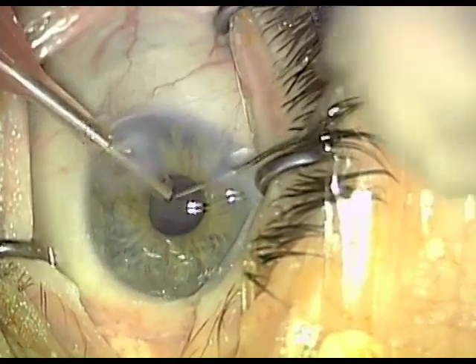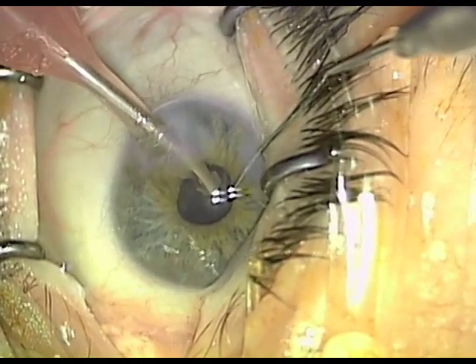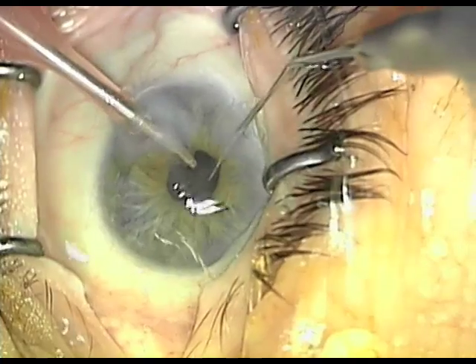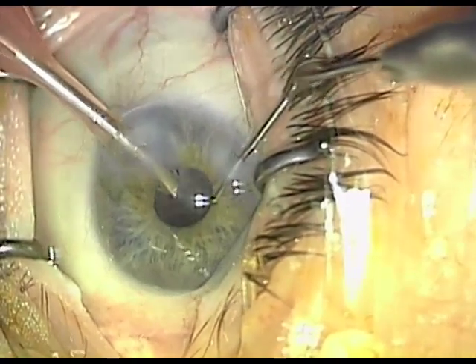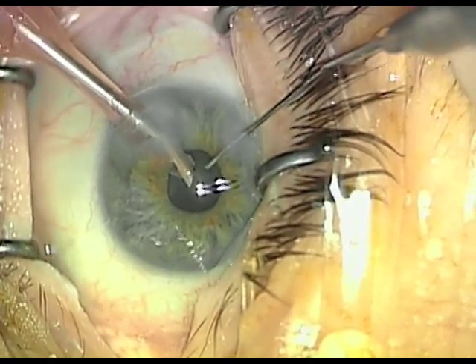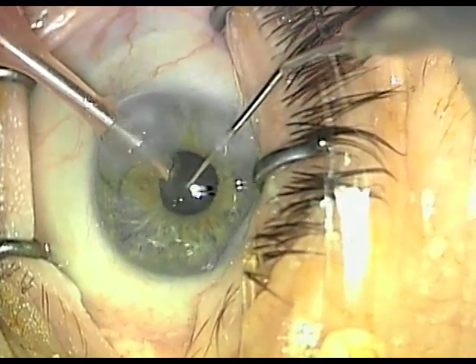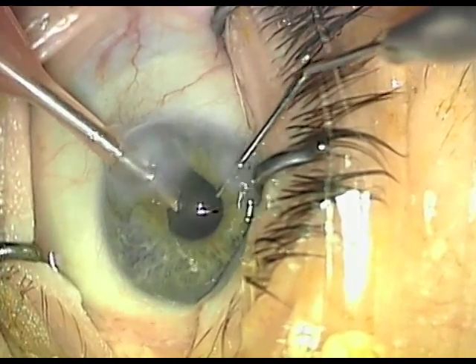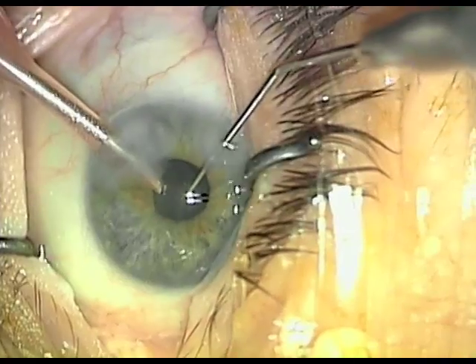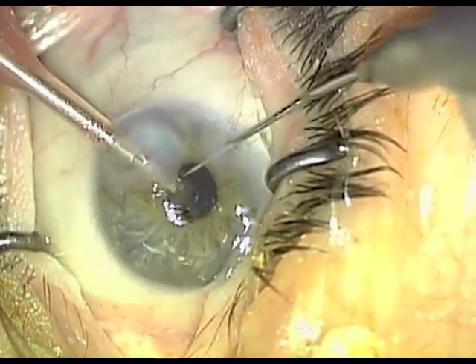If such cortex remains, you can either use the momentum technique as demonstrated in a previous video or segmental removal, but it's important to make sure that there are no pieces trapped underneath the iris or in the sulcus at the conclusion of the procedure. You can use the Nagahara instrument as I'm using here to expose the iris in different quadrants to see if there are any remaining fragments to be removed. Turning the port sideways does help a little bit to get better occlusion, to pull the pieces into the iris plane where they can be chopped, vacuumed, or aspirated using the help of the second instrument.